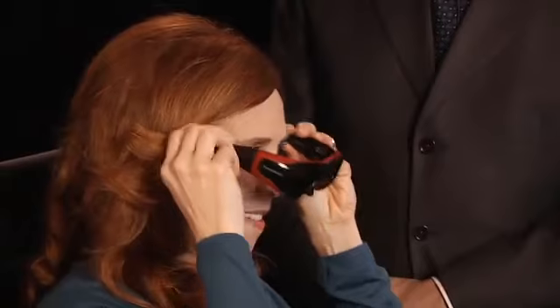Okay, Kelly, what we want to do now is measure your subjective angle. That's where your eyes will perceive two targets at the exact same time. So the first thing I want you to do is put on the glasses. The glasses are flipping back and forth so that she sees one target with each eye. She's seeing the parrot out of the right eye and the cage out of the left eye.